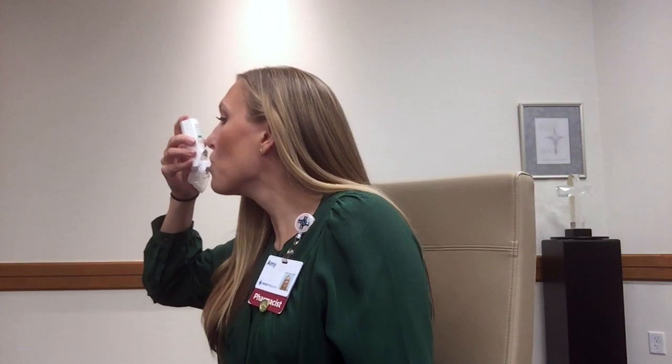Now let's put it all together. Be mindful of the dose counter on the back of your inhaler to make sure that you request refills in time so you don't run out of your medications. Thank you.